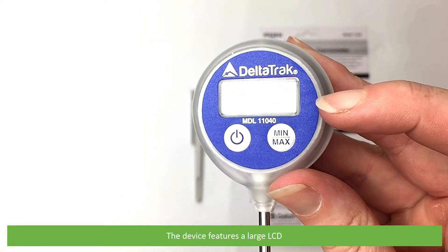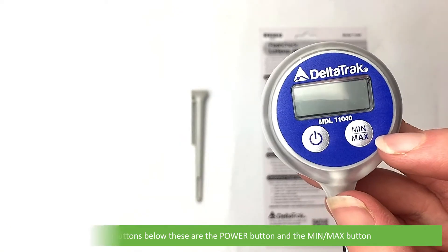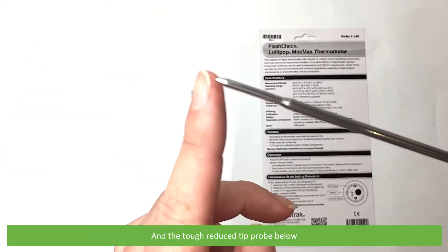The device features a large LCD with two buttons below. These are the power button and the min/max button, and the tough reduced tip probe below.